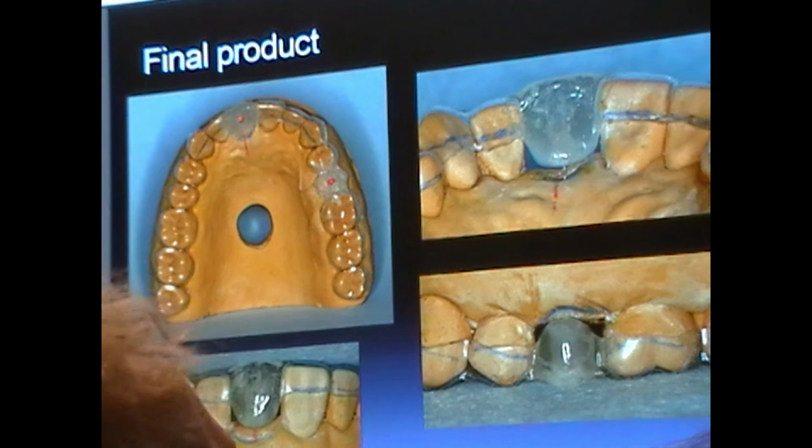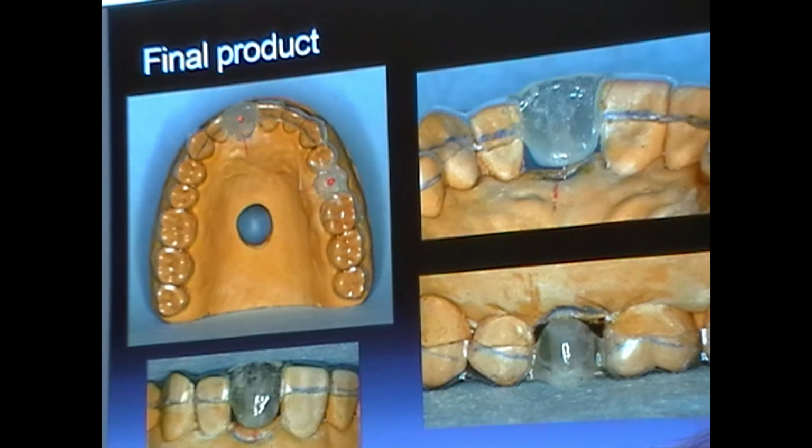That's important so that as the surgeon is performing their surgeries and doing their first pilot holes, they can see the tip of their instrumentation, okay? So you might want to start off making sure that it's touching, but then we're probably going to ask you to relieve that so that you can see at least a millimeter of space, okay? Or even if you place the surgical round burr there, or even the inverted end, that you can see just a little bit of space of your long shank burr, all right?